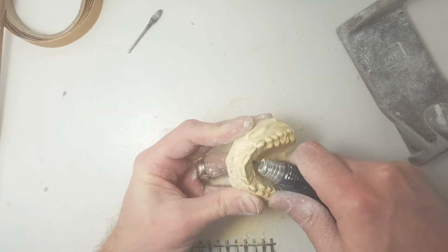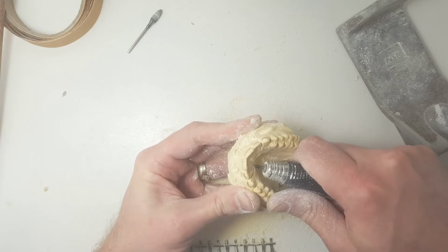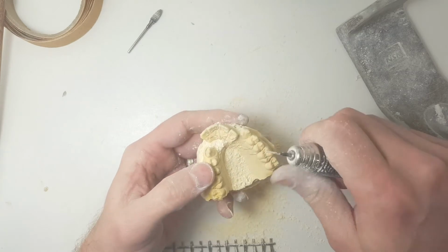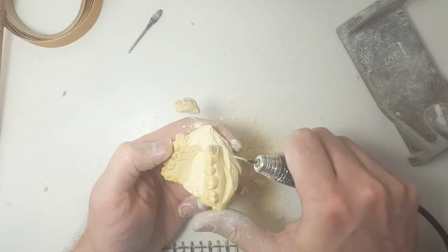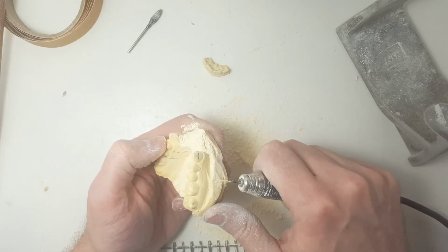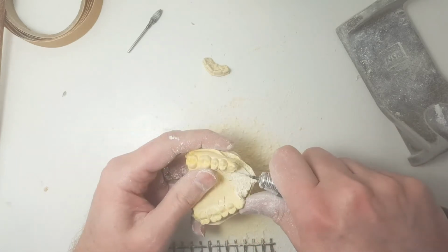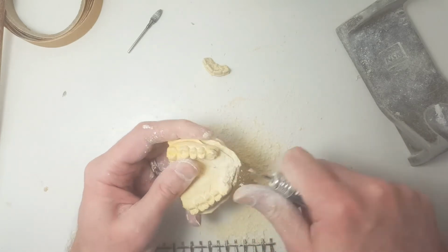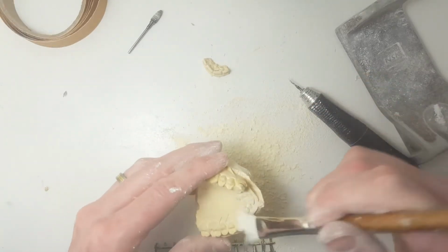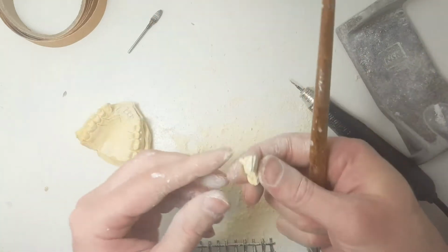I like using a foot pedal. I like to use variable speed, so you'll hear my handpiece speed up, slow down. To me that keeps it from, sometimes you'll be going so fast that it will actually get clogged up and just start polishing and not cutting. So I'm going to just cut little grooves. Probably not necessary, but I just like to think the wax gets locked in there easier, and that way the whole thing doesn't just slide out as a unit.